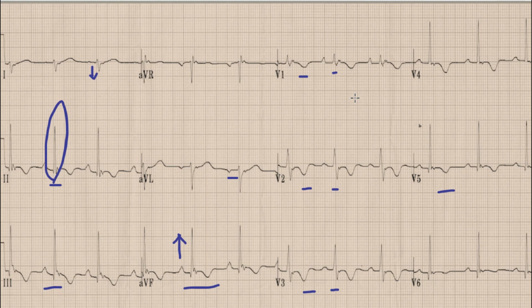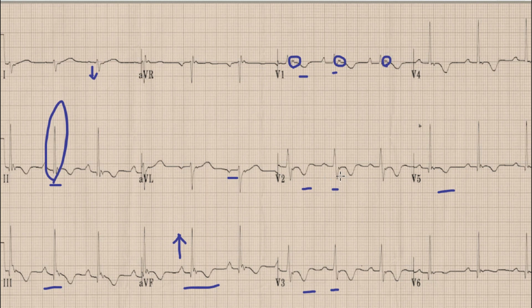Another very important finding in this ECG is the presence of a prominence after the QRS complex in lead V1 — a small hump after the QRS complex in lead V1. Similarly, you can also find this prominence or hump in lead V2.